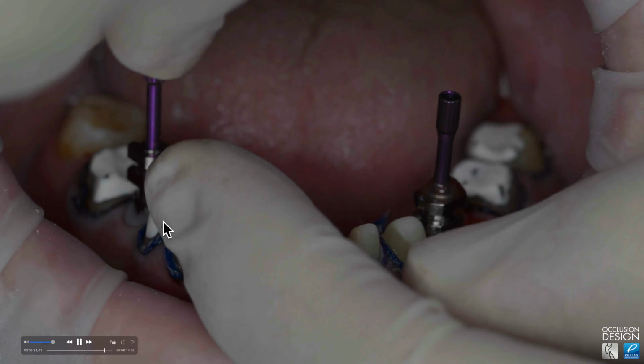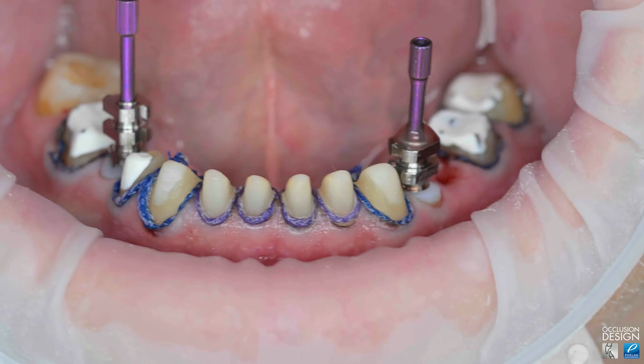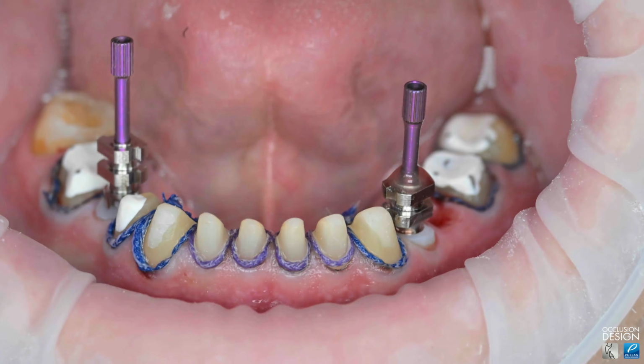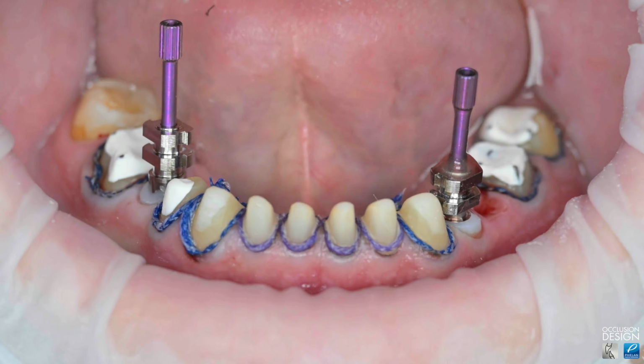It's a bit of a challenge, this kind of case, because you've got a lot going on here. And I did a lot that day. It was a long day. Patient was really good. He held up really well.